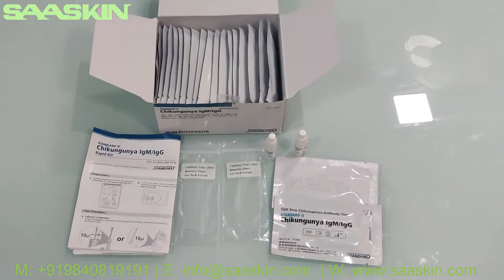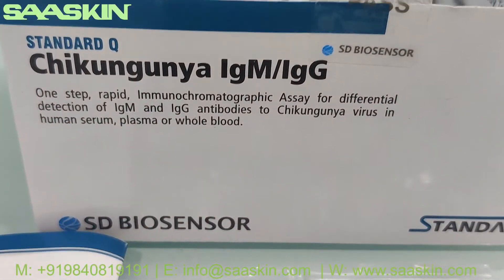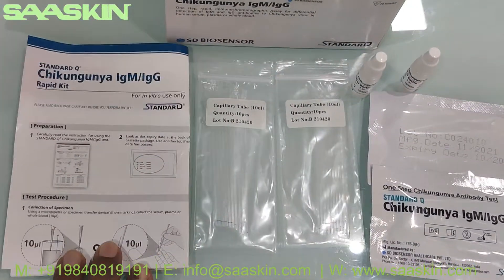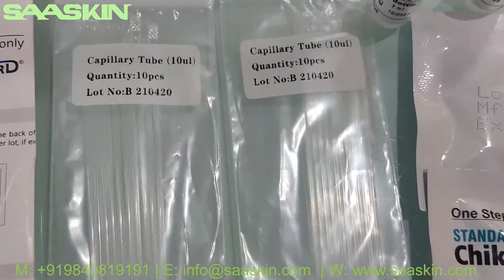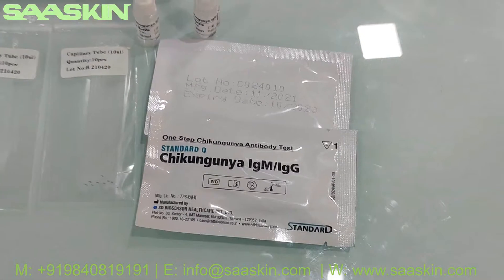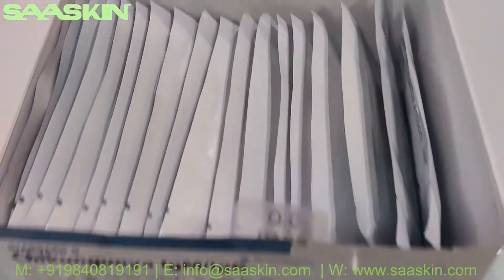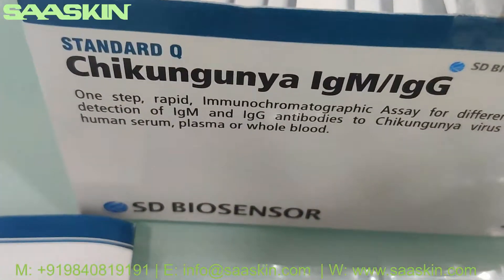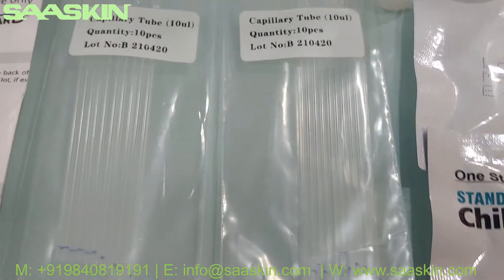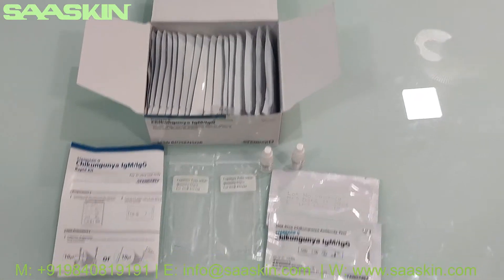So to summarize, the 20-test kit box of SD Biosensor Standard Q Chikungunya IgM IgG antibody test kit contains one instruction manual, 20 specimen transfer devices, two buffer bottles, and 20 test cassettes. This is how the complete kit looks. Thank you.